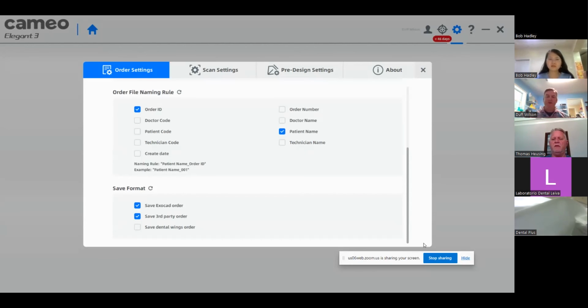So I think that would be a great addition to the kit, to have a laminated sheet that was gridded out so that doctors could mark the tips and they know when to throw them away.